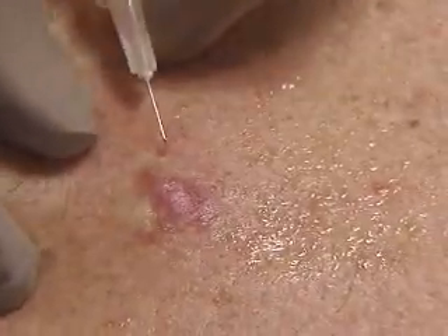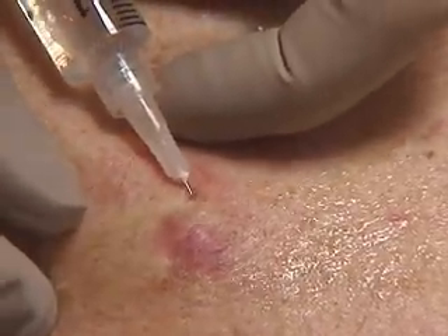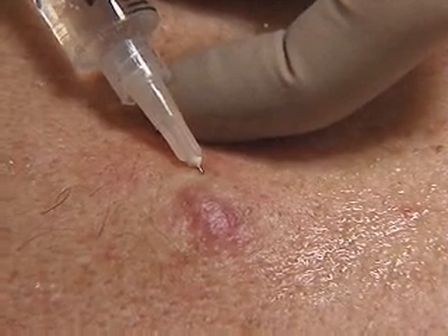We'll change angles and re-inject now to increase the coverage. Better if you can do this without withdrawing the needle fully.